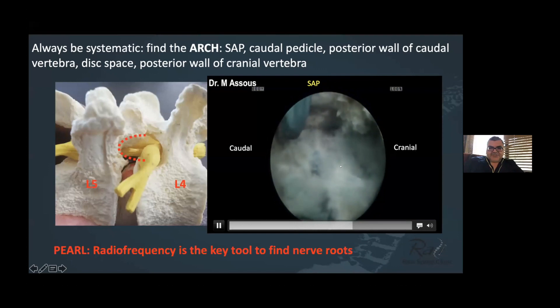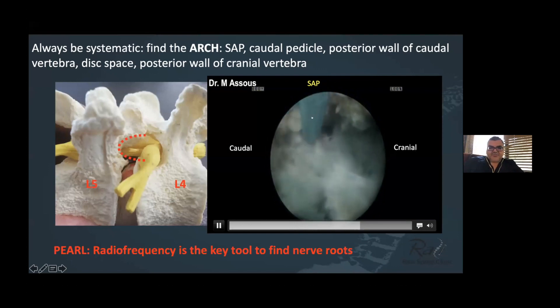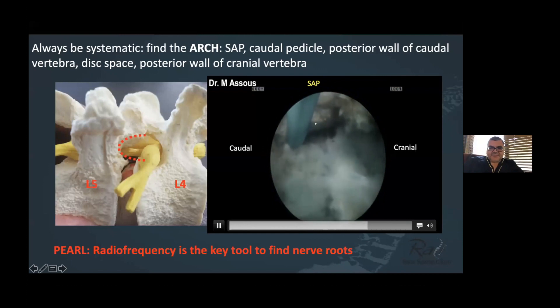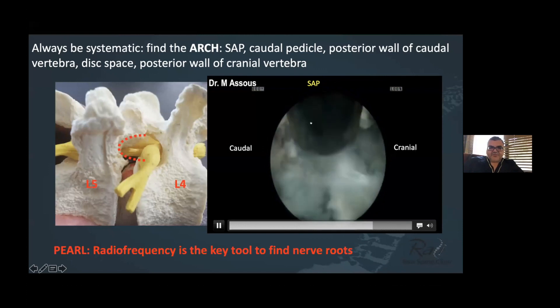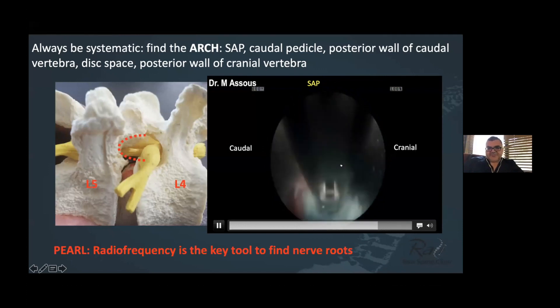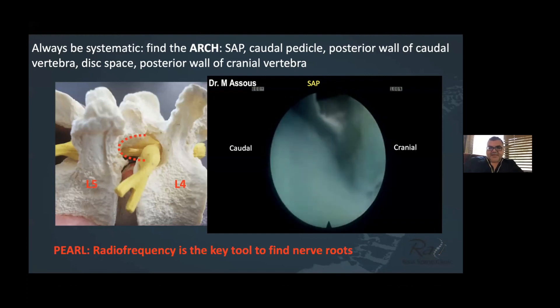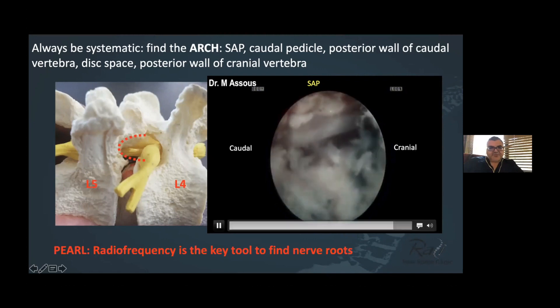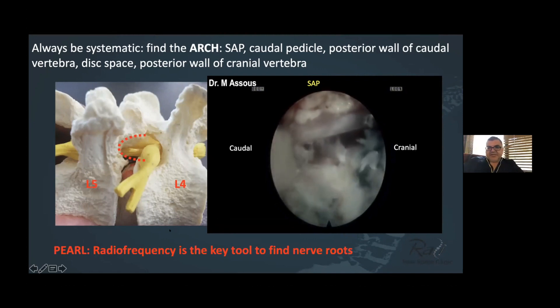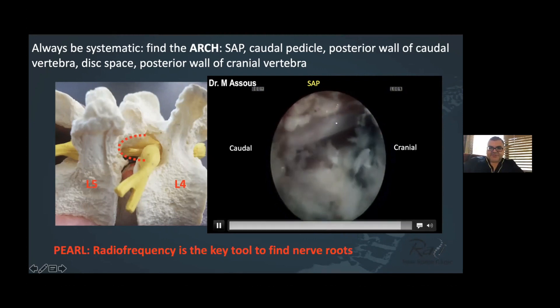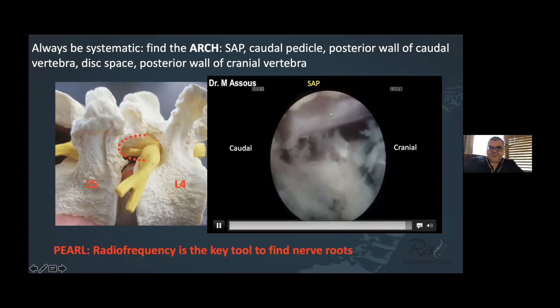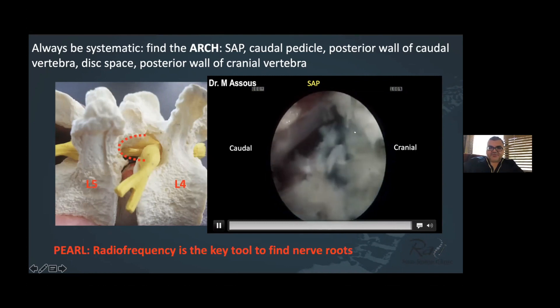Anything you push into the canal parallel to the posterior vertebral wall is safe. The root is not lying on the posterior vertebral wall — you can see where the root is, it's starting to peek out. This is the traversing L5 nerve root, and this is the disc herniation. You take the disc — this case done under sedation in the lateral position — and at the end of surgery you see a free and mobilized traversing nerve root.